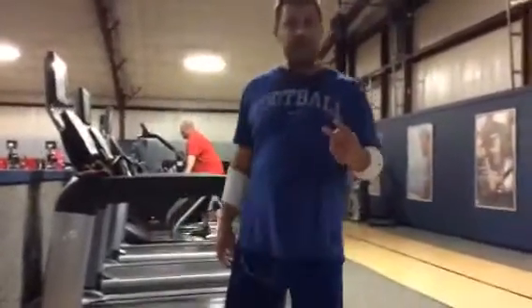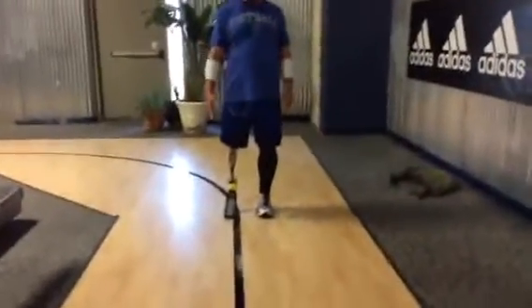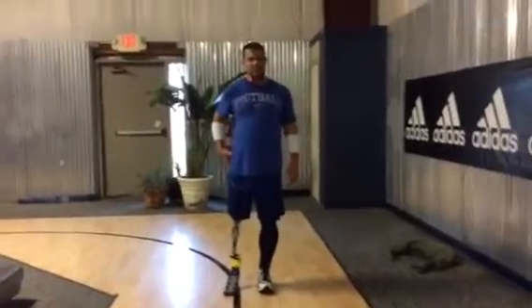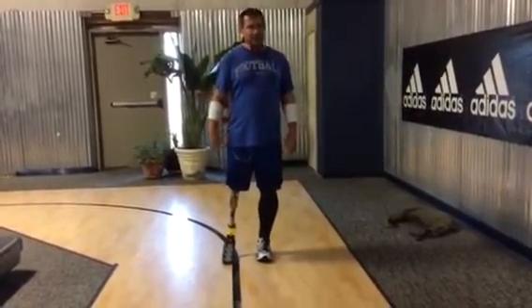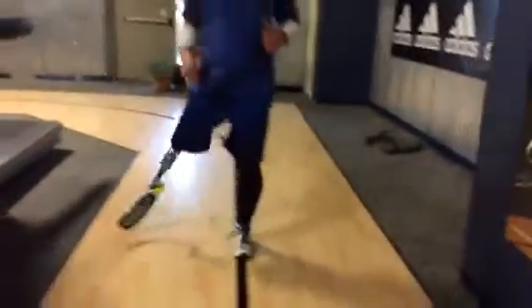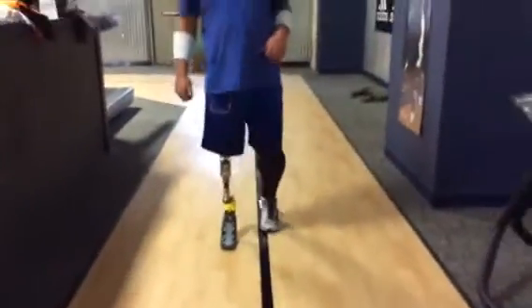So those are the two running styles, the bent knee and the circumduct. I'll do both of them again one more time. The circumduct comes to the side. It uses less of your thigh muscles and uses more of your hip. It's less taxing, but you can't do quite as many things. You can also use it to go backwards.